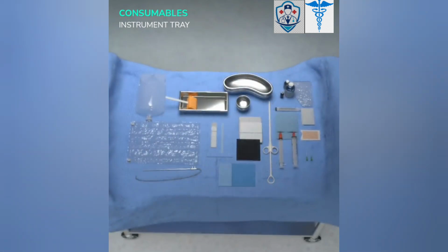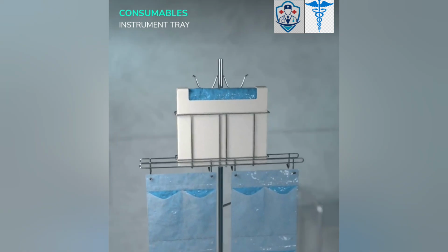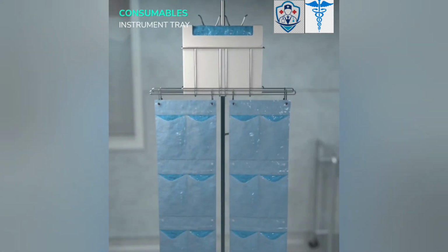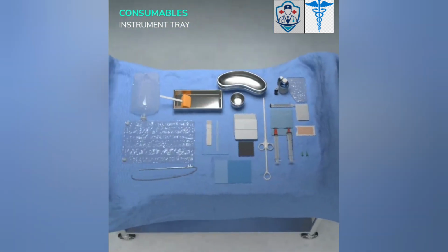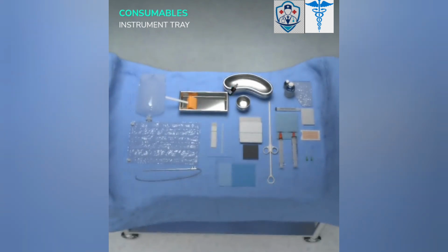A scratch pad is used to keep electrosurgical instruments clean of charred tissue or debris. A swab counting bag can be used for convenient counting, handling, and disposal of contaminated swabs. An anti-fogging agent should be applied directly onto the laparoscope lens to condense steam into larger droplets, so as not to obscure the camera view.